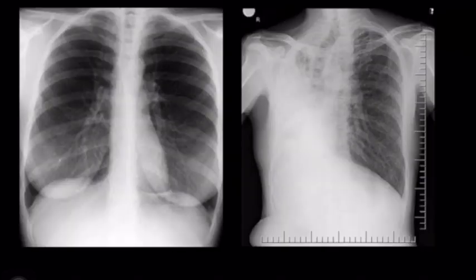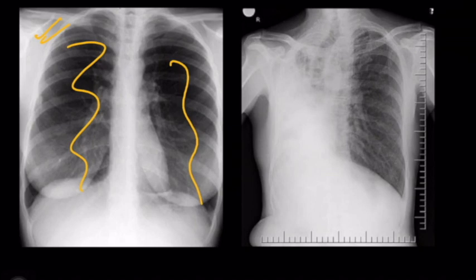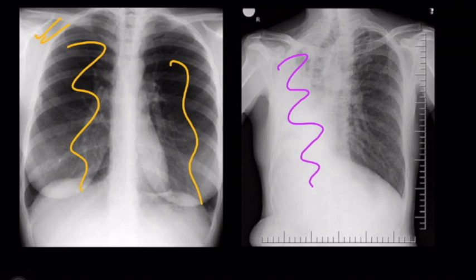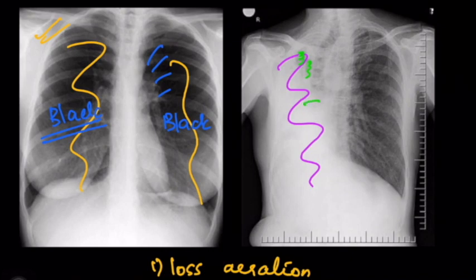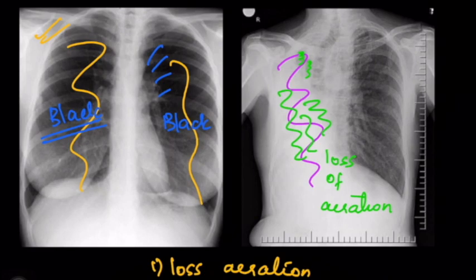Looking at the figures, on the left the lung fields appear normal — a normal chest radiograph. Comparing with the right figure, there is a huge radiopacity in the right hemithorax. This is the sign of loss of aeration. The well-aerated lung fields appear black on chest radiograph, but here there are almost no black areas — the rest is occupied by white areas — indicating loss of aeration, which is one of the direct signs of collapse.